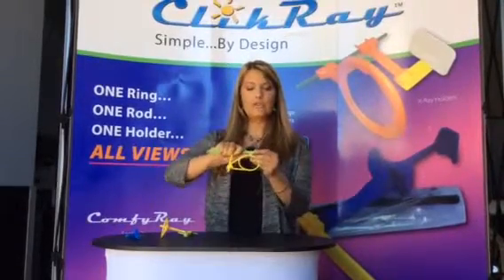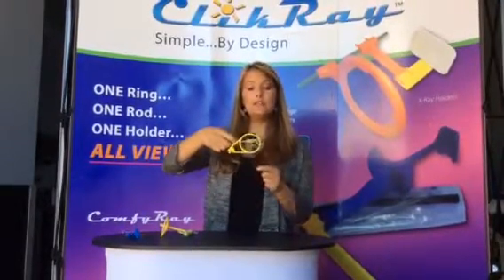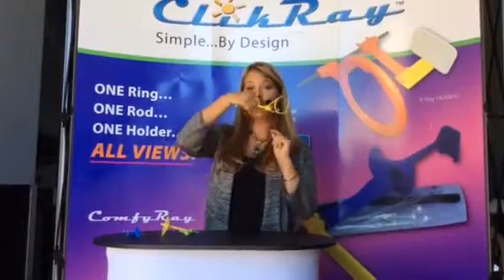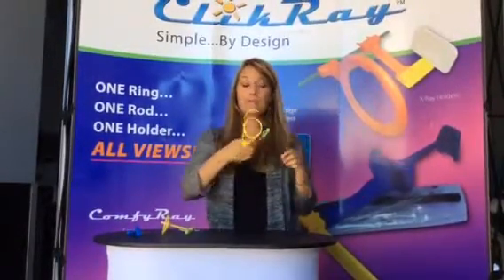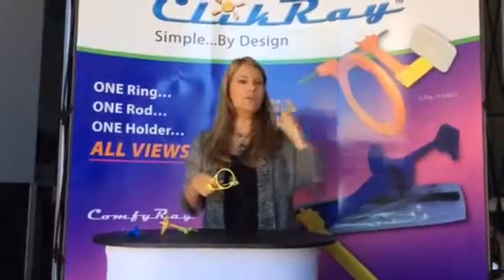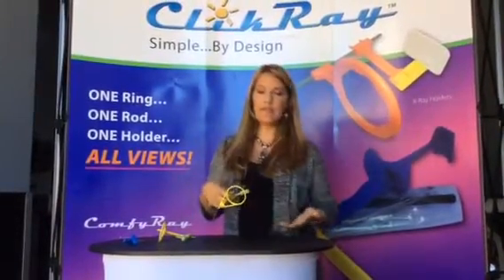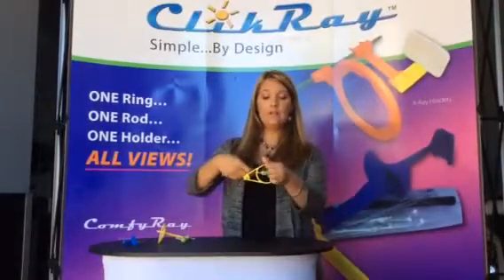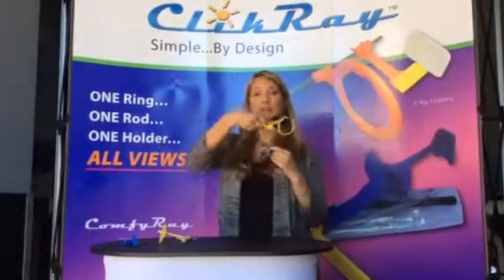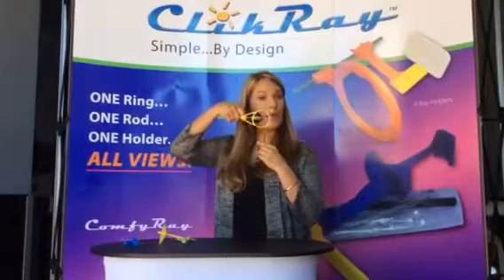We're going to click this into the highest position, slide our sensor to the highest position, and take our anteriors: one, two, three, one, two, three. We also get a lot of questions about vertical bite wings, and it's very easy to do with this system as well. You're going to slide your sensor to the middle, click your ring to the middle, and you're able to take vertical bite wings.